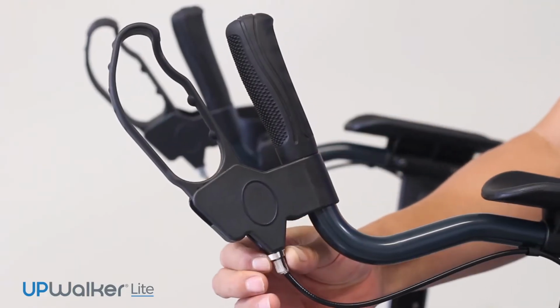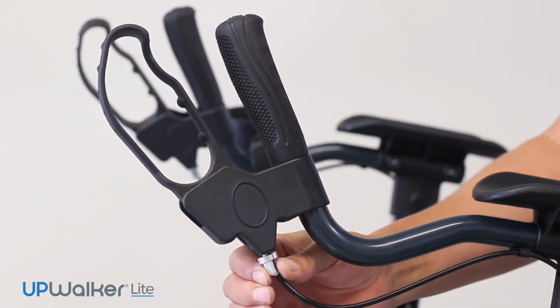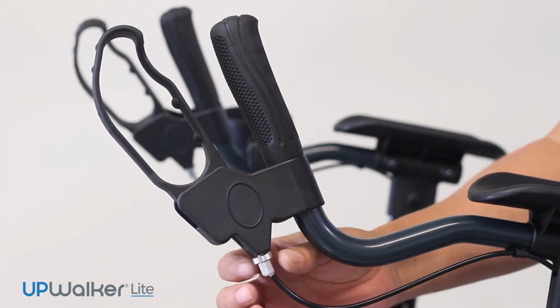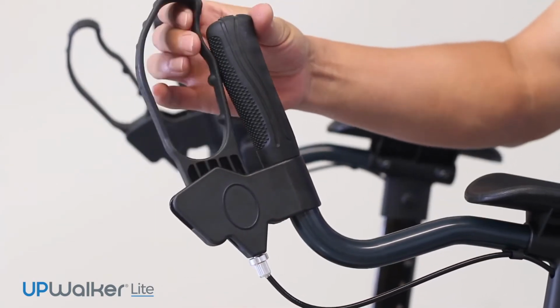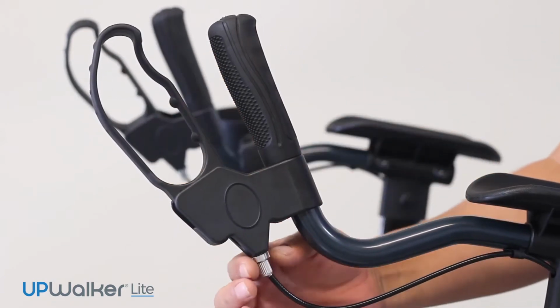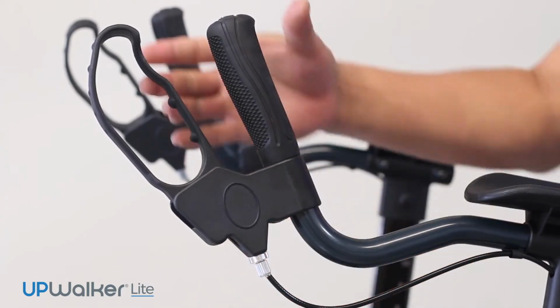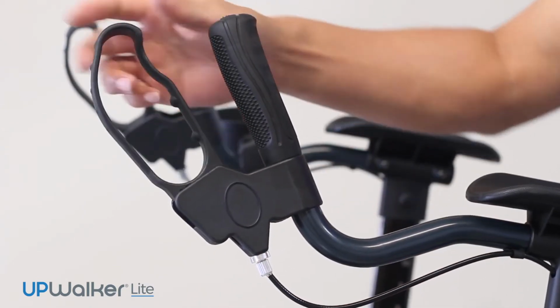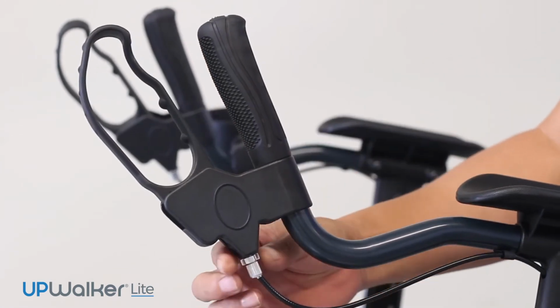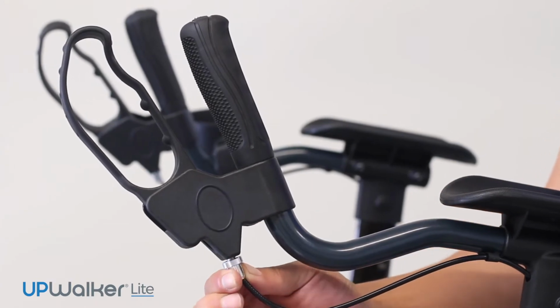If after making adjustments using the gray knob back at the back wheel, you still have not achieved the desired firmness of the brakes, then you will go up to the brake handle where you will notice two nuts underneath the brake handle. Again, if this adjustment using the gray knobs has not achieved the desired braking strength, use the adjustment option on the brake handle end of the brake cable.